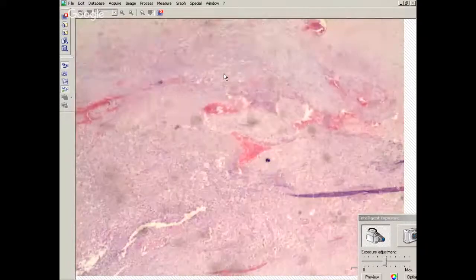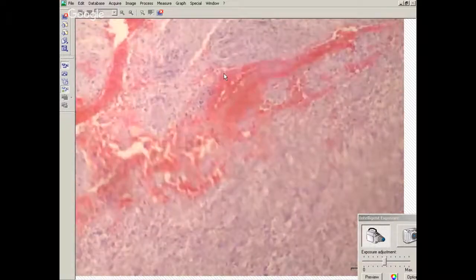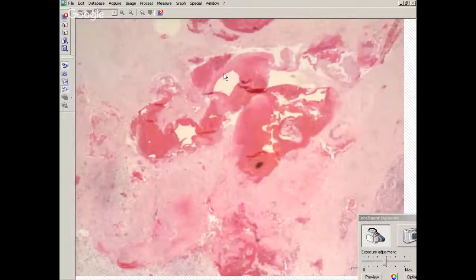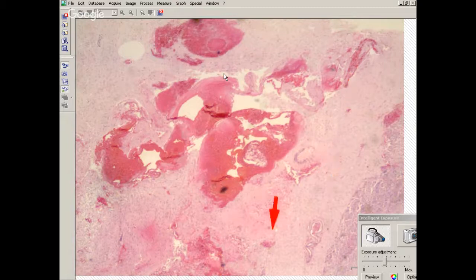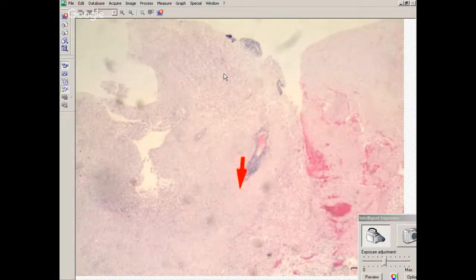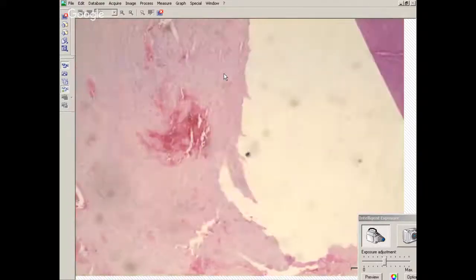Might be another one. I mean, this is a high-grade glioma, and it's infiltrating into the parenchyma. There's focal brain tissue in the specimen that's probably another piece adjacent to it that's not been infiltrated as much. You can sometimes have chronic inflammation around blood vessels in high-grade gliomas. It doesn't mean that it's not a glioma. You can even have acute inflammation. That doesn't mean that it's not an infiltrating glioma.